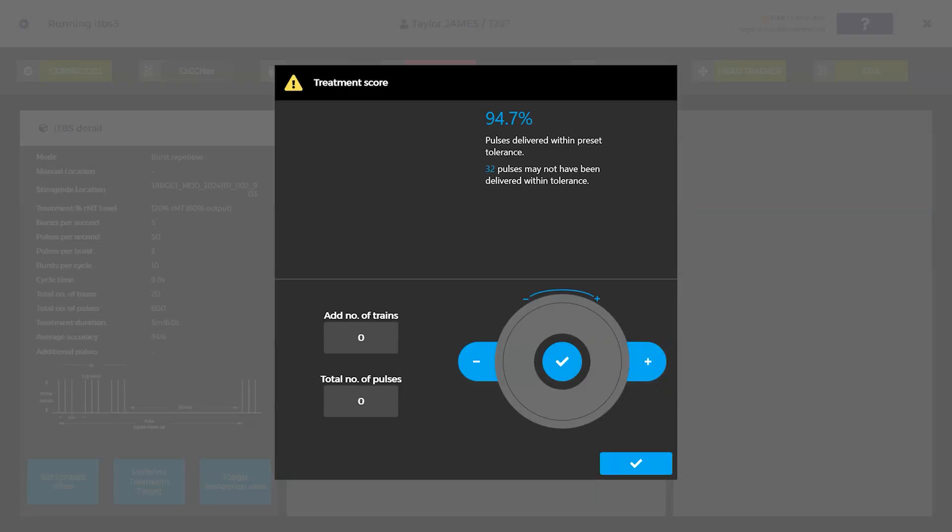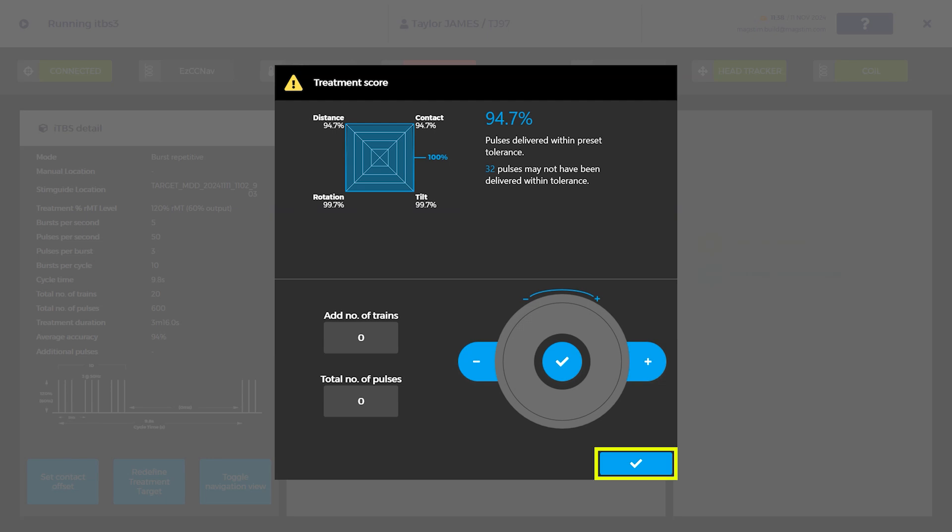Once the treatment is completed, the system will display a pulse quality score that indicates the number of pulses delivered within the specified tolerances relative to the four parameters. A prompt will appear with an option to deliver additional pulses, up to the number of pulses which may have been out of treatment position. Use the control dial to choose the number of pulses to deliver. Press the check icon to return to the treatment run screen to deliver the additional pulses.